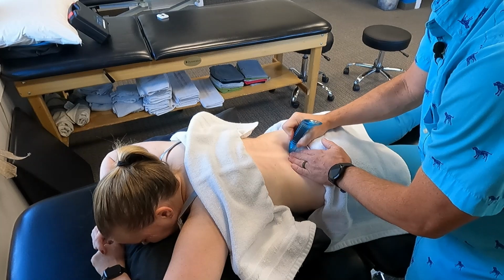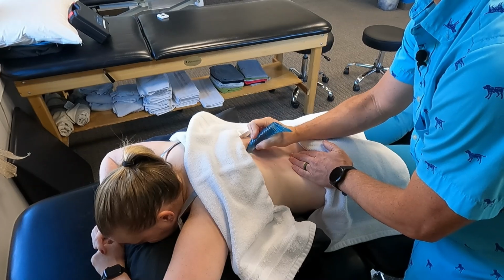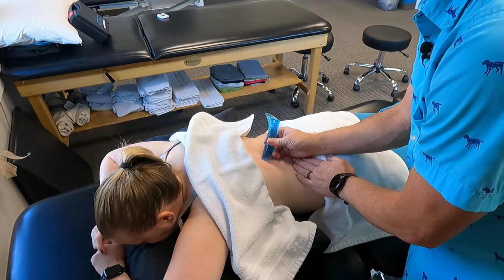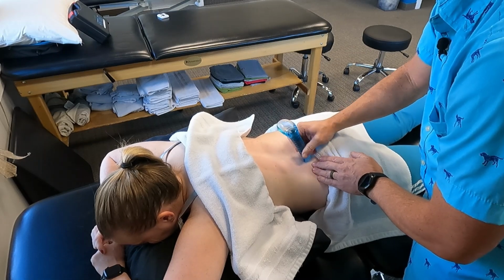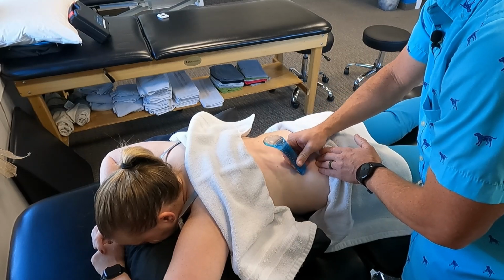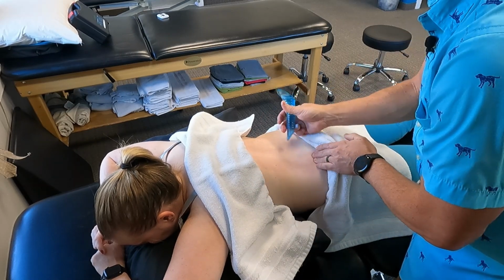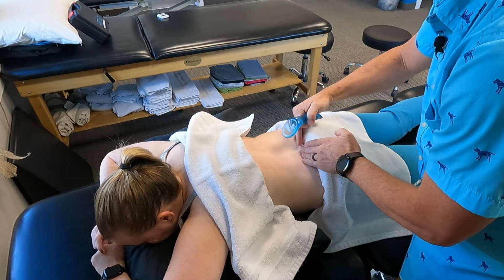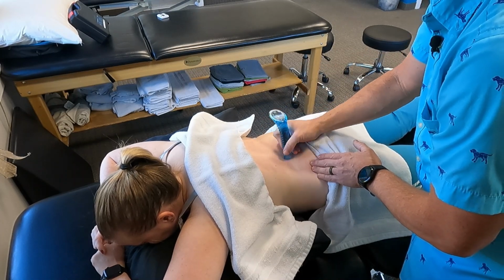The tool gives you a good opportunity to feel what's tight and the texture of the tissue, which tells you the health of the tissue, how much collagen is disorganized. On the back usually it's pretty smooth, but if you're doing this on tendons or you get down to some of the attachments in the pelvis, then it can be a little more textury. So we go on the paraspinals. I'm going on the thoracolumbar fascia that comes out, kind of like a big diamond in the low back where all the muscles attach into. So trying to hit all of that thoracolumbar fascia.